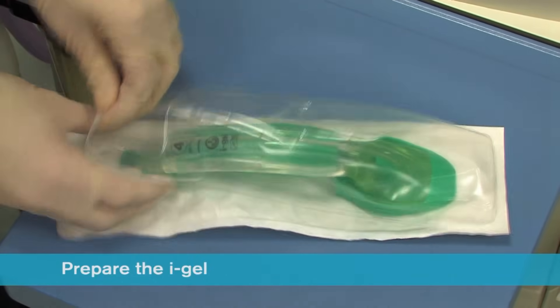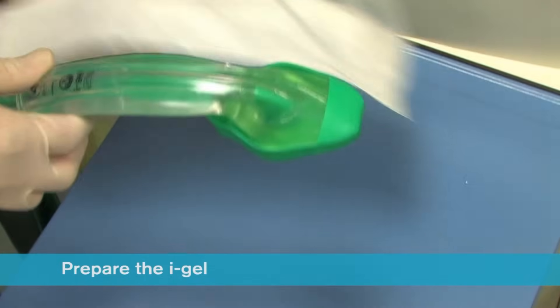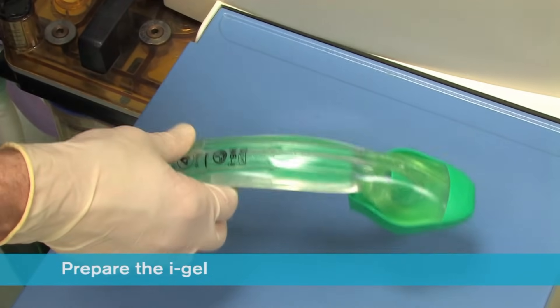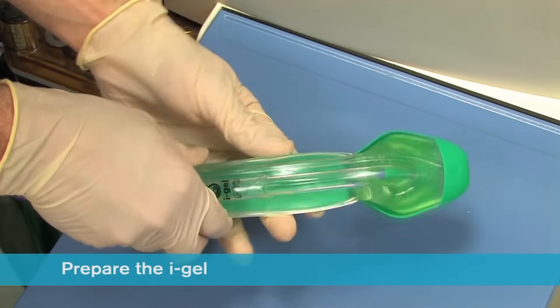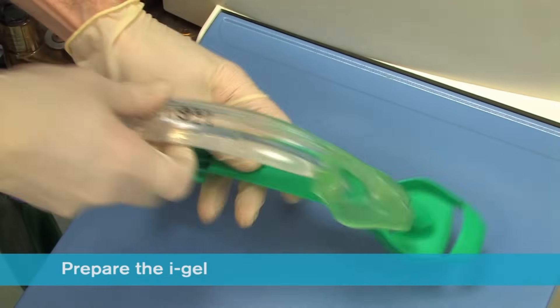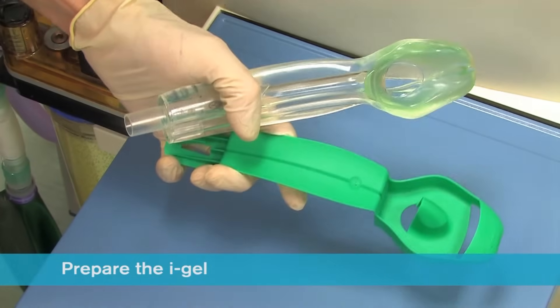Ensuring that you conform to local policy for hygiene, open the iGel package and on a flat surface, take out the protective cradle containing the device. In the final minute of pre-oxygenation, remove the iGel and transfer it to the palm of the same hand that is holding the protective cradle, supporting the device between the thumb and index finger.